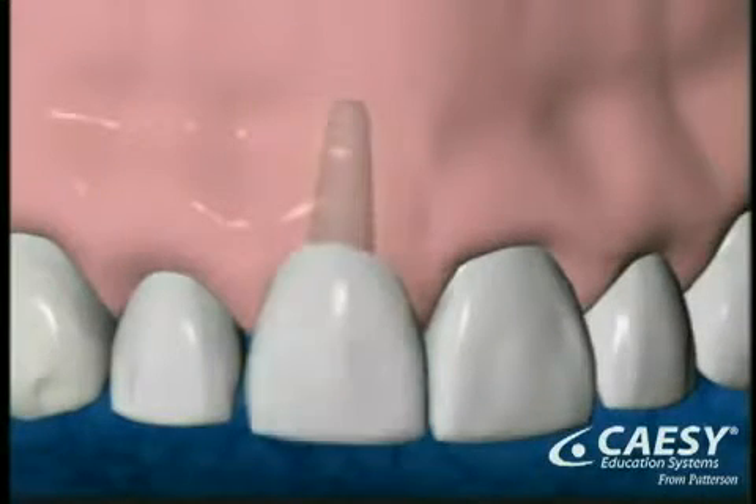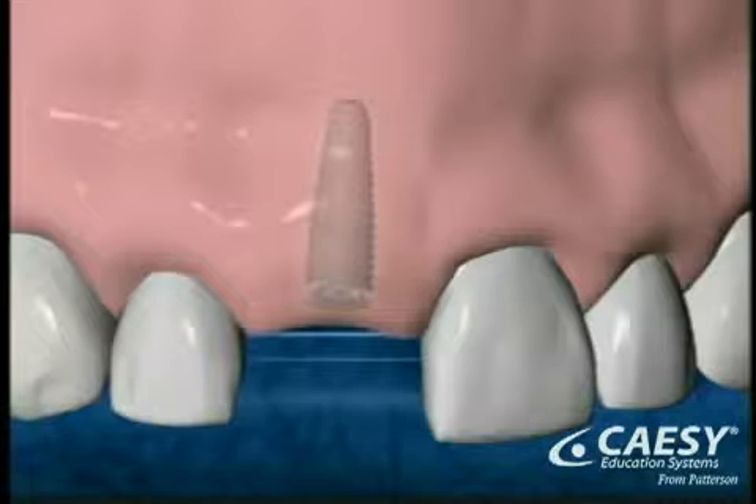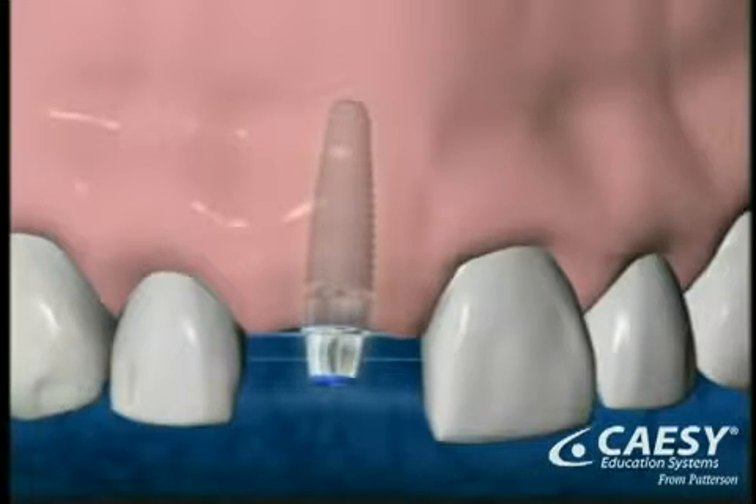Restoring your mouth with a dental implant is accomplished in two phases. The first phase of the procedure is the surgical placement of the implants. They're under the gums for several months while the bone attaches to them. After healing, the second phase begins. The implant is re-exposed and your new crown is made.